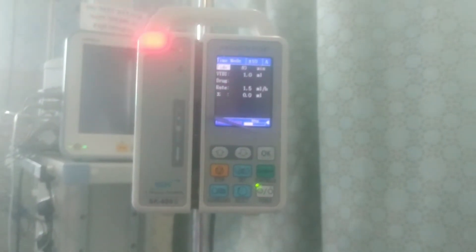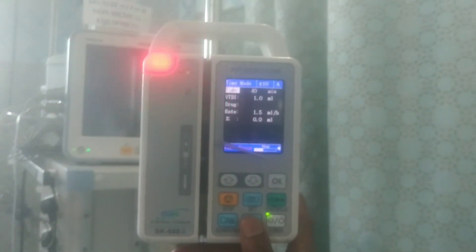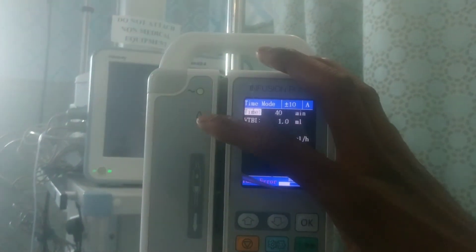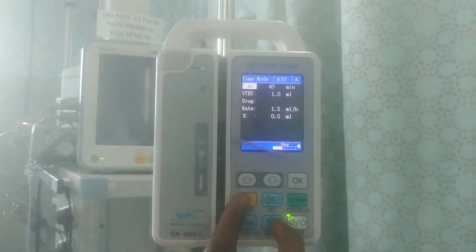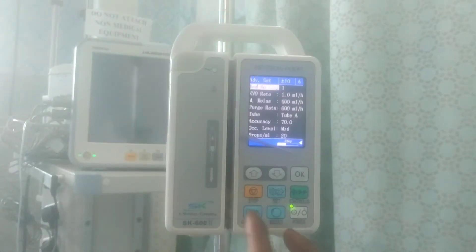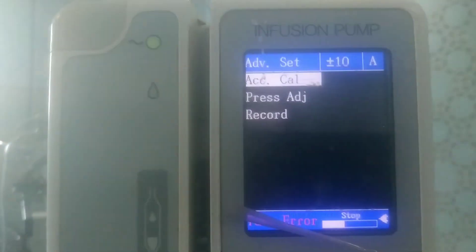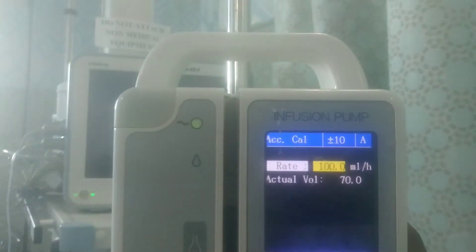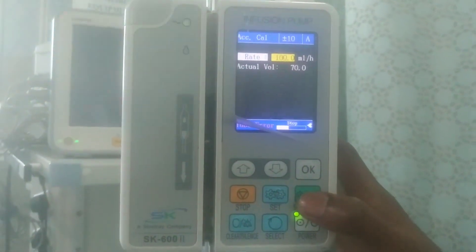Next, I'll show you how to calibrate the infusion pump. To enter calibration mode, hold the select button and the stop button simultaneously. This takes you to a calibration interface. Scroll down to find 'accuracy calibration.' Click OK, then set your parameter to the number you want. After the settings, go to start and kickstart the calibration.